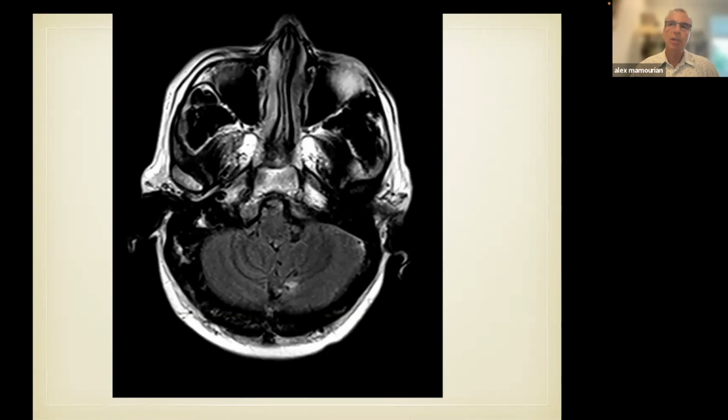If you say to me, you have a patient in the emergency room who has a very suggestive history, negative CT scan, and they're on anticoagulation, and there's a risk of doing a lumbar puncture, or there's no one available to do a lumbar puncture in the middle of the night, then I think it's reasonable to do a CTA.